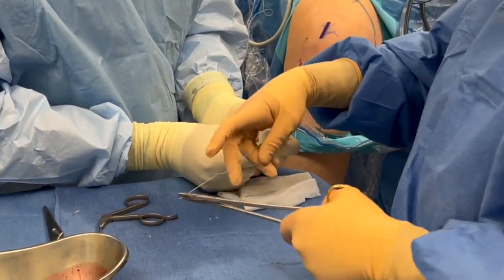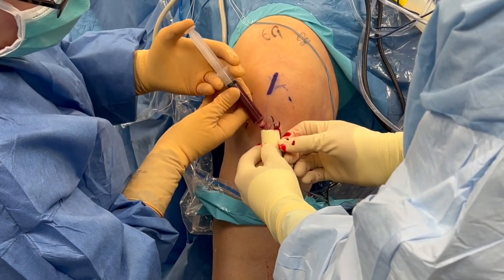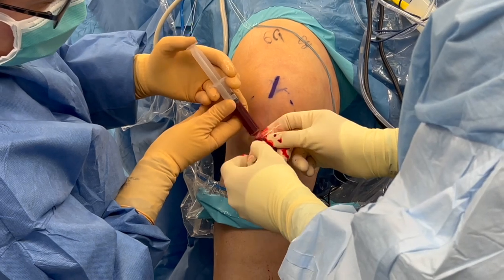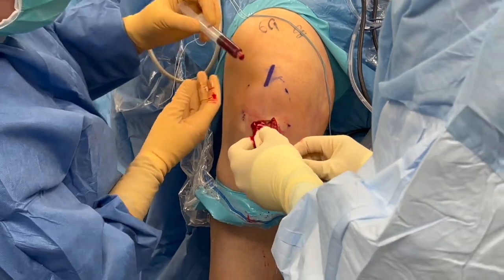We're going to get 20 cc's of whole blood, which is being taken while we're doing this. We're going to traction the implant all the way down to the joint and then start to place the blood. You can see it's starting to soften — when it starts to soften you're ready to insert it into the knee. You don't want it fully softened because you won't be able to get it into the knee joint.